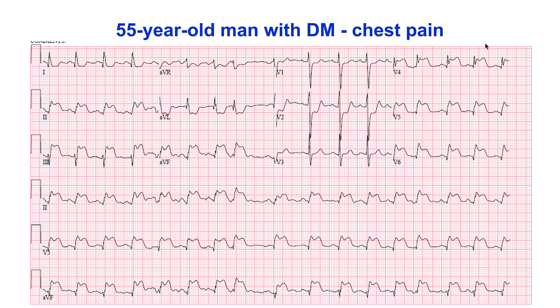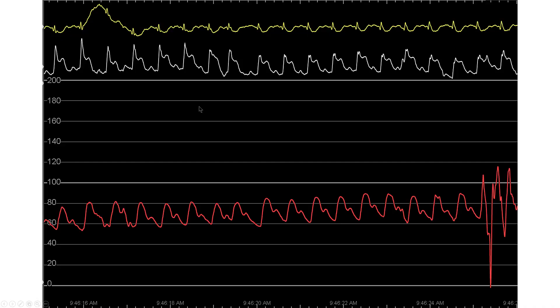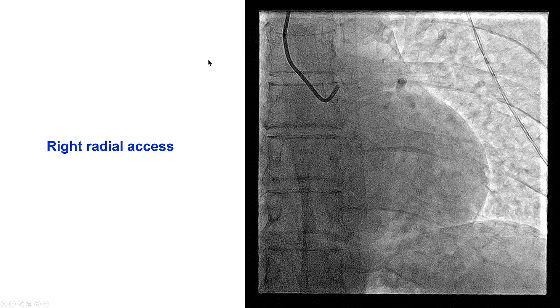The patient had diabetes and presented with chest pain. EKG showed marked elevation of the ST segments in the inferior as well as the lateral leads with reciprocal ST-segment depressions. He was taken emergently to the cath lab, and he was hypotensive on arrival with a systolic blood pressure in the 80s and marked ST-segment elevation.